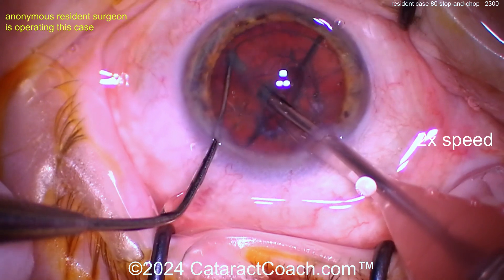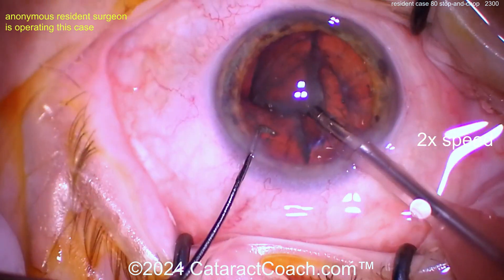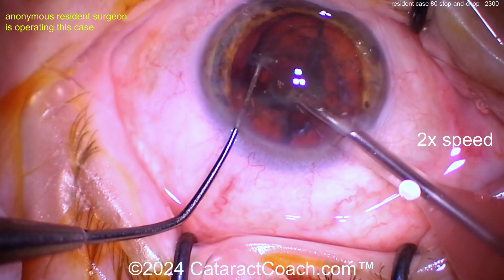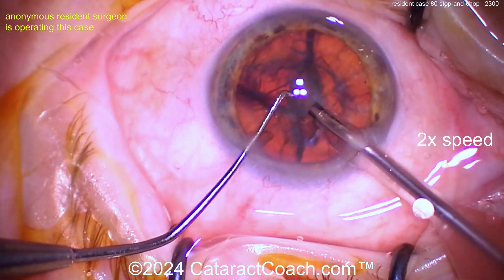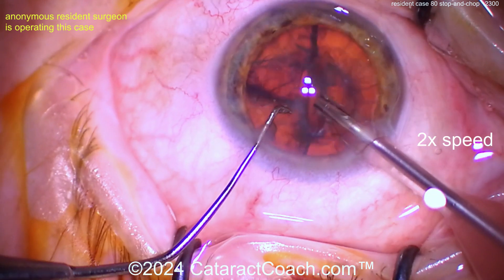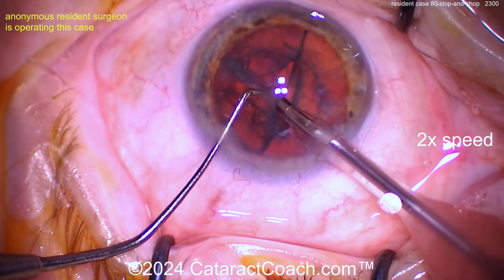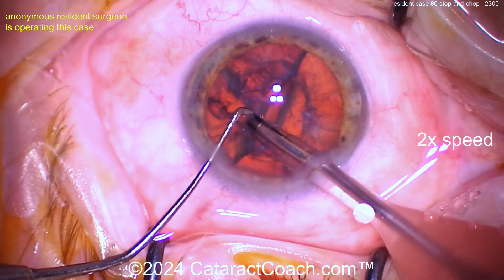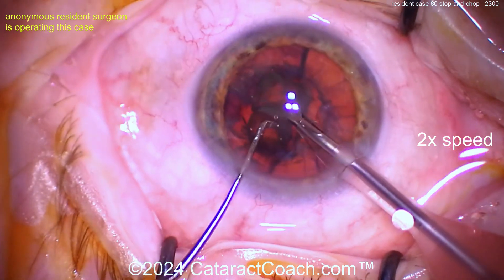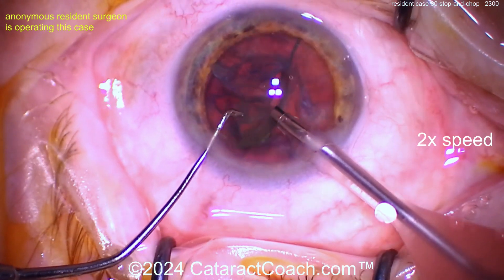Buzzing in with the phaco probe and chopper going around — a little horizontal chop there. Very nicely done, I'm really digging it. You're doing a great job. Bring the eye back to primary — there you go. Just take your time, get these quadrants out, chop the other half. You can even sub-chop if you want. Almost got that one — good try. Bringing it up — pretty good again.